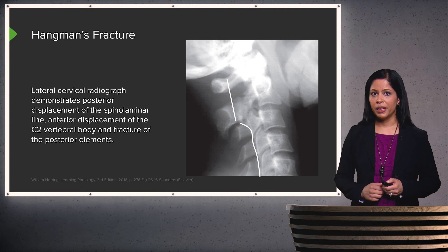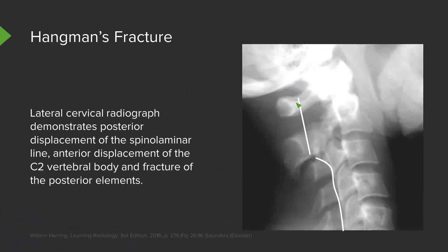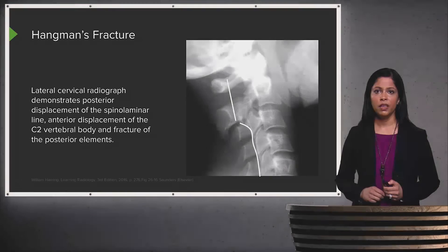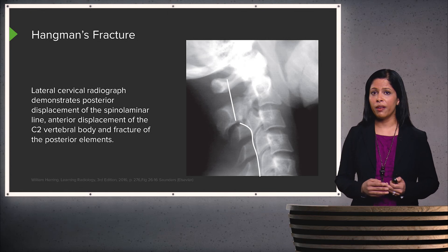This is an example of a hangman's fracture on a lateral cervical radiograph, demonstrating posterior displacement of the spinal laminar line. The line should remain symmetric all the way up and down, but here there is posterior displacement followed by anterior movement. There is also anterior displacement of the C2 vertebral body and fracture of the posterior elements of C2. These common spinal fractures are very important to recognize because they may have chronic neurological deficits associated with them.